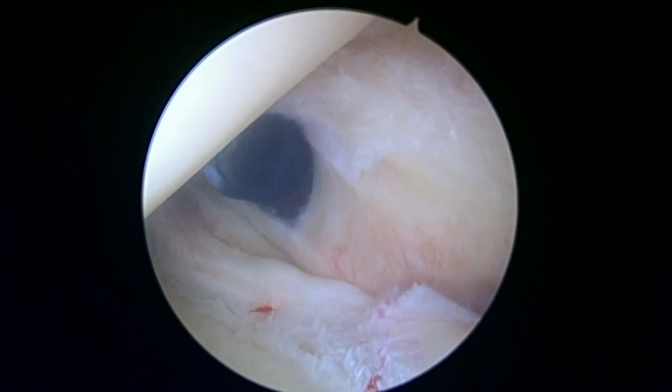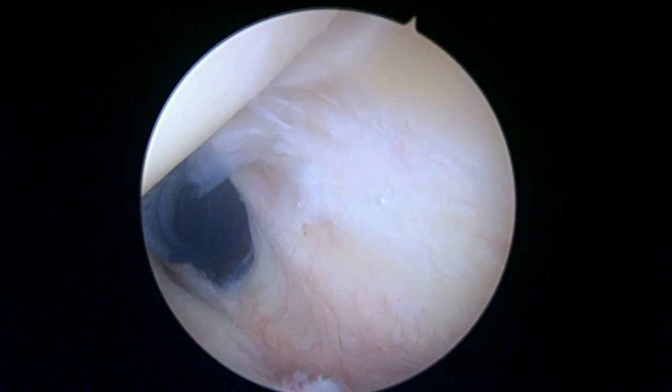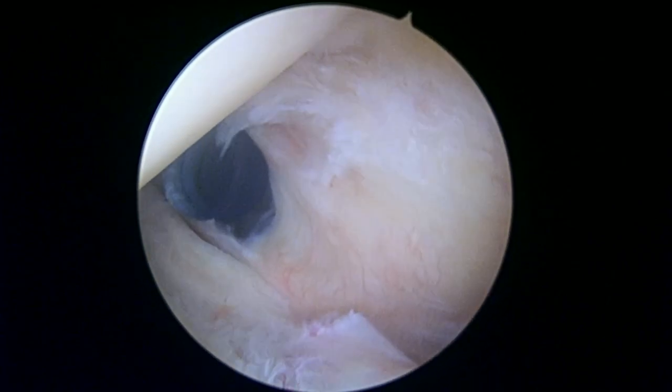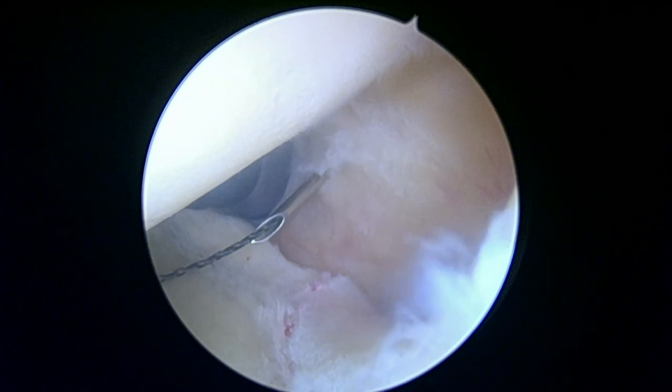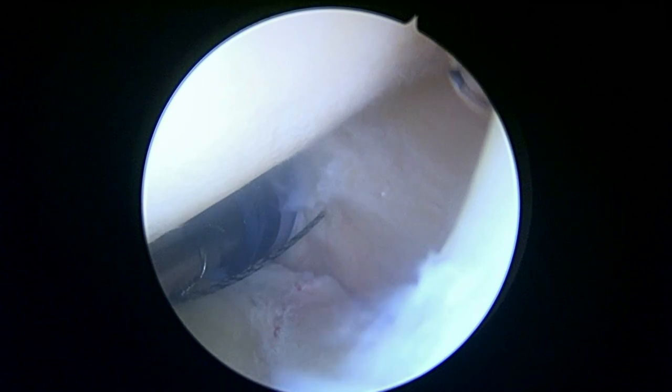We're going to pass a provisional marker stitch across this — we'll show you more in a minute. We're passing this spinal needle across the distal side of the tear here, the posterior side of the tear, and then we're going to back out the needle and pull that through and load it with a suture. This is going to serve two functions: one is it's going to allow us to find this part of the tendon very quickly when we change positions with your shoulder, and the other is it'll function as a suture we can use as part of any repair we may have to do.